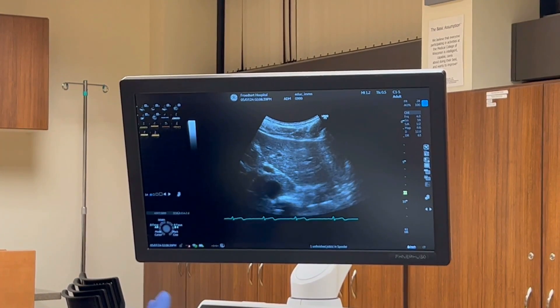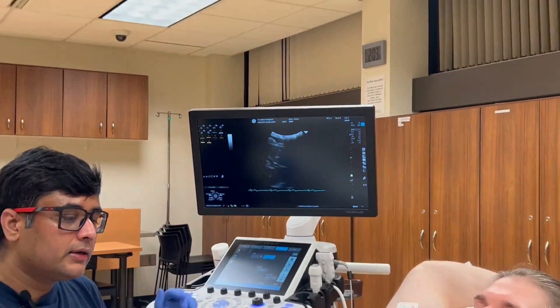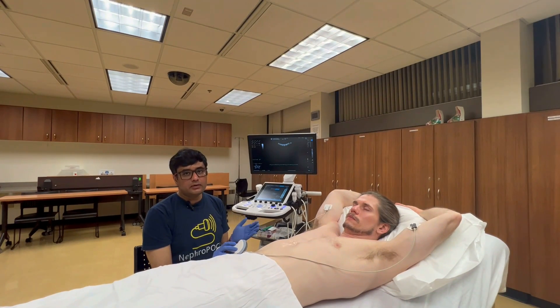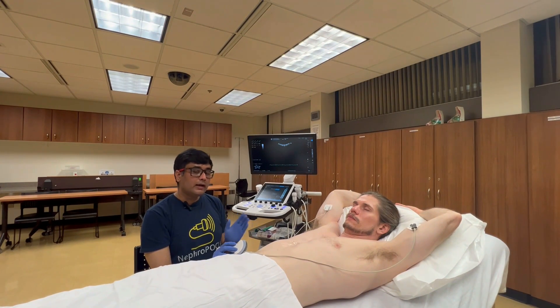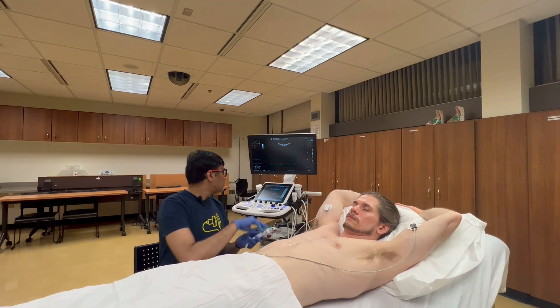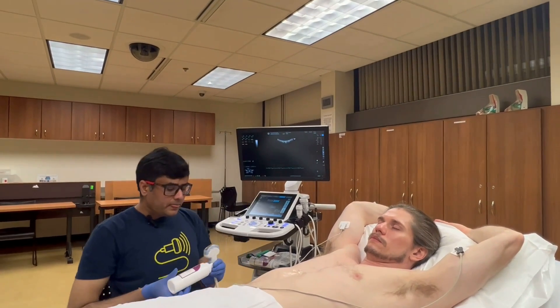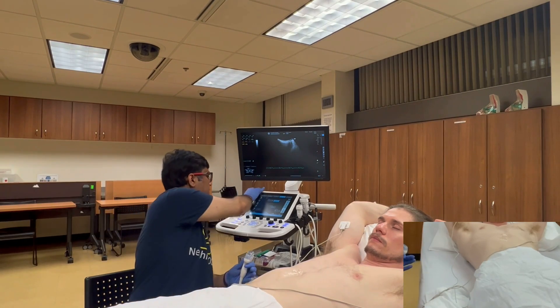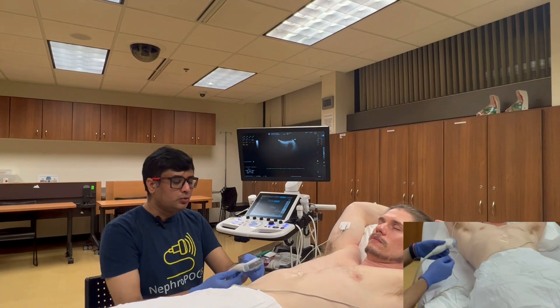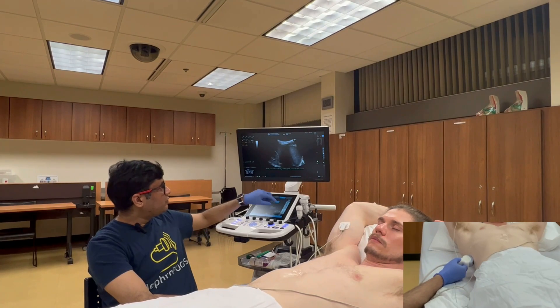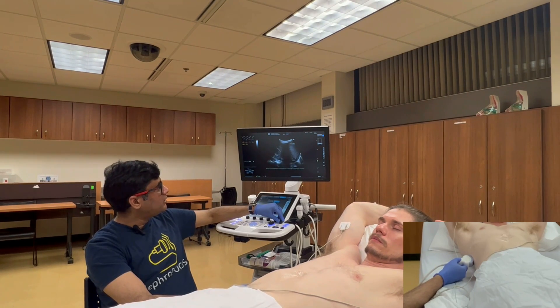Once you do the IVC measurement, I'll go to the right upper quadrant and do the rest of the Doppler assessment from there, because we are likely to get better waveforms using this window as opposed to the sub-xiphoid window. I'm placing the transducer with the orientation marker towards the patient's head in the mid to posterior axillary line where I expect to find the liver. I'm going to increase the depth a little bit.